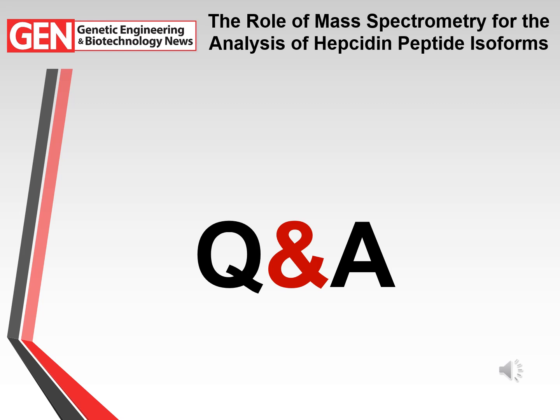But in terms of a data biobank, if we're looking at trying to do thousands of samples, then as we move forward, we will need to develop methods that are much faster, because a lot of methodologies take about 15 minutes per sample, and we really need to get that down to about 1 to 2 minutes. So there will be developments in the future as we move into doing large biobank studies.